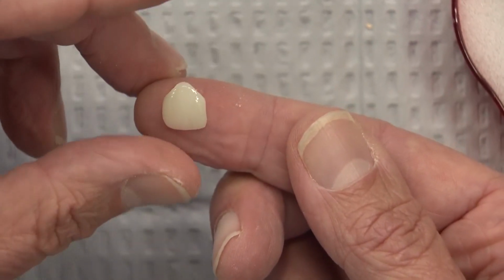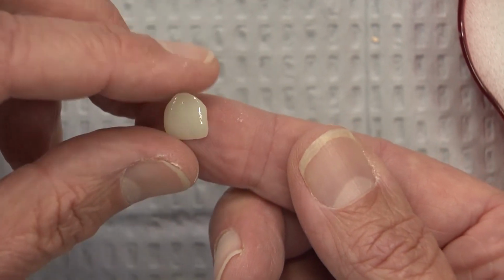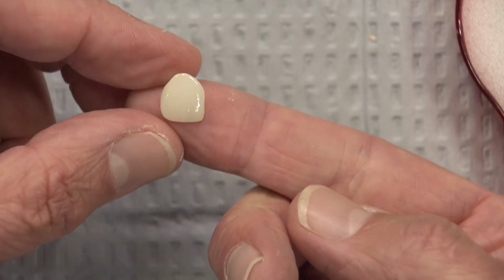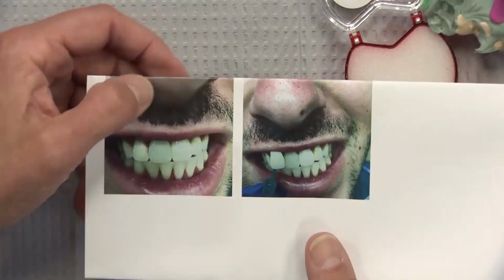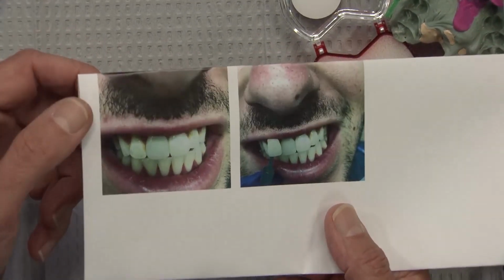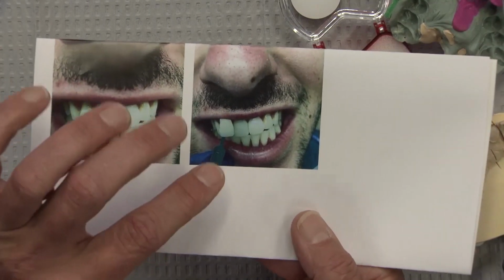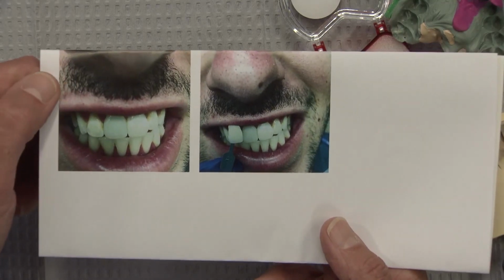The issue was it was being placed on a tooth that had had endodontic treatment. When the doctor put it in place, even though this is an A1 shade, which is the shade the doctor requested, it did not look like that in the mouth. The dentist sent a picture along to show how grayed out that anterior BruxZir crown became when it was placed on that dark stump. And here it is in place with the Vita A1 shade tab next to it.